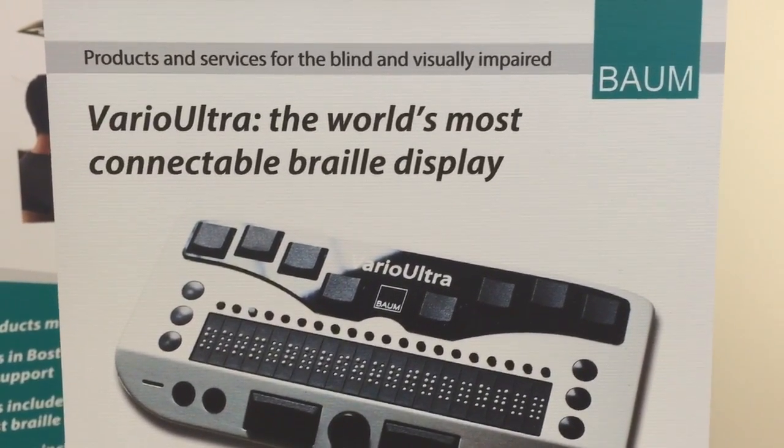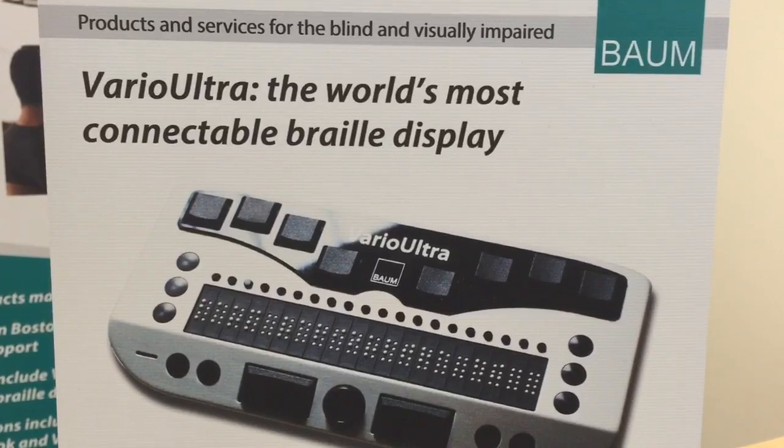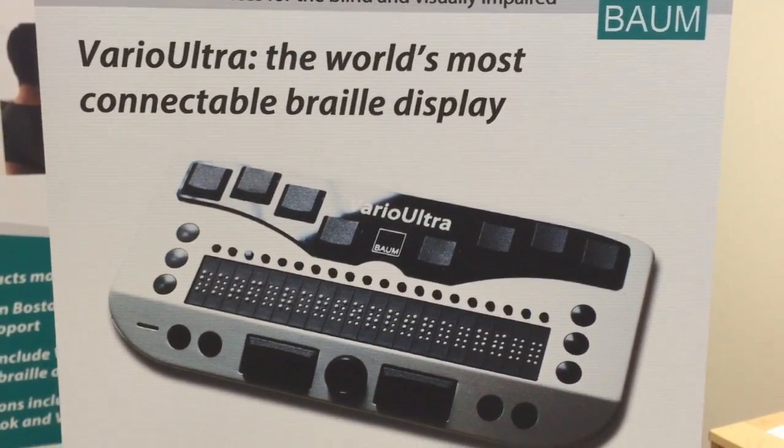Hello, this is David Bradburn with BaumUSA. Welcome to this review of Vario Ultra 20 and Vario Ultra 40.